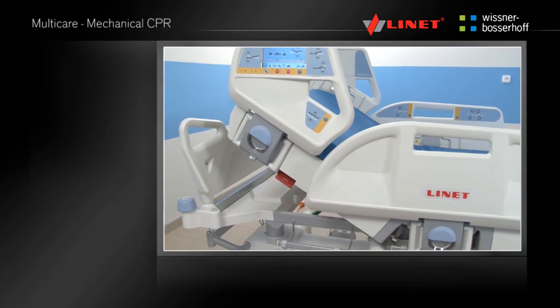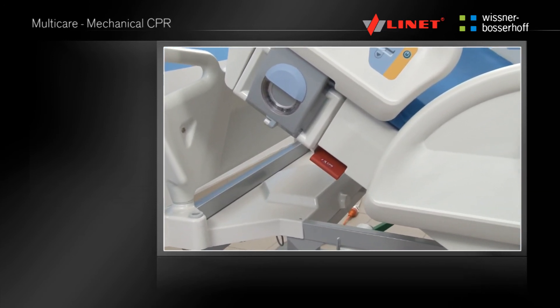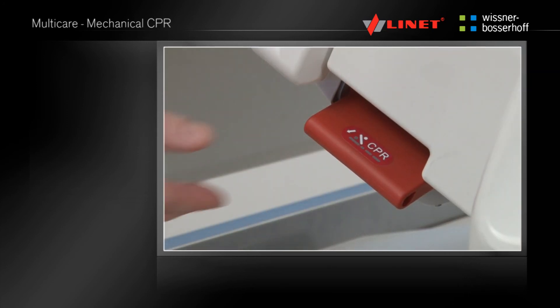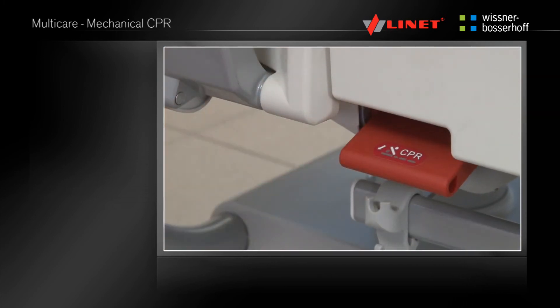The backrest needs to be flattened quickly for CPR. The mechanical CPR is a red lever located on both sides of the bed under the head side rails. Unlock the CPR by pulling the lever out from the bed and holding until the backrest is flat.